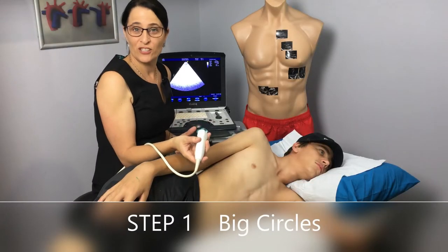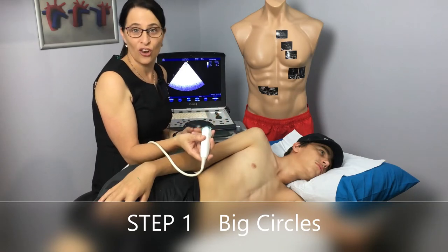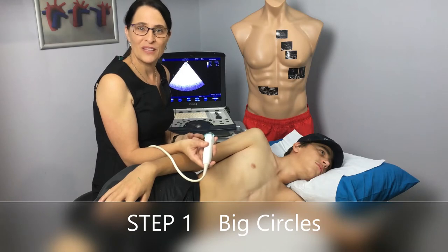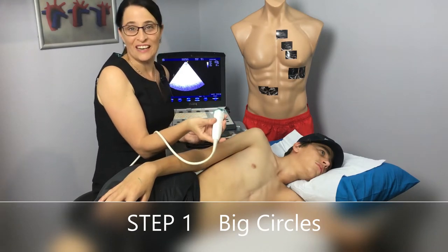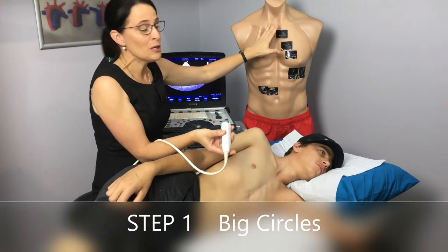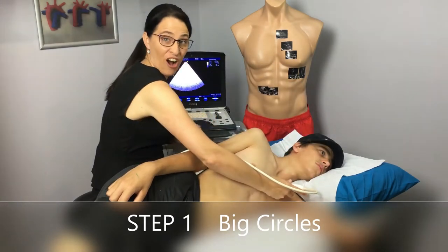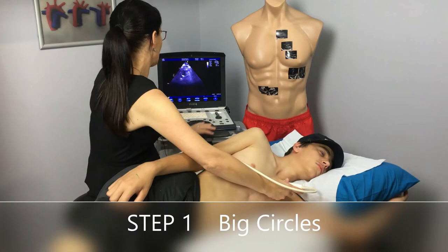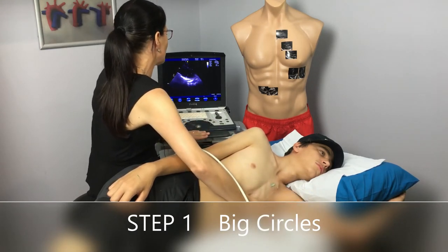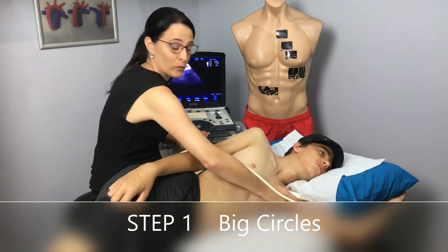I would like to demonstrate five things you should do when obtaining a parasternal long axis image. Step number one is big circles. Be a little wild when you start and check the lie of the land — say hello to these three potential parasternal images. I recommend starting high close to the sternum, moving down the sternum before heading out lateral to complete the circle, and doing this two to three times.